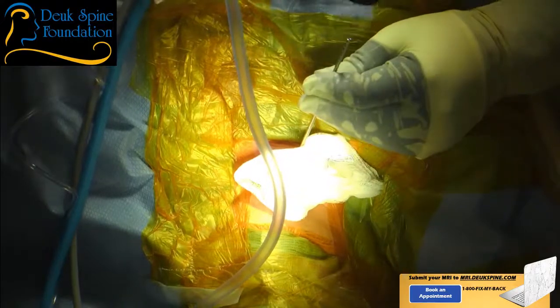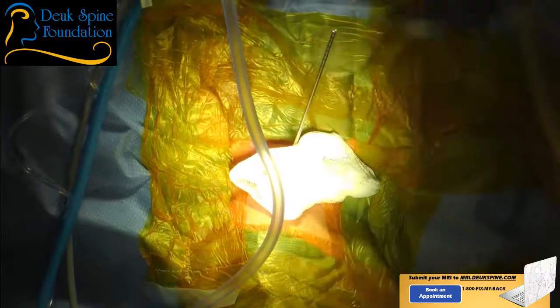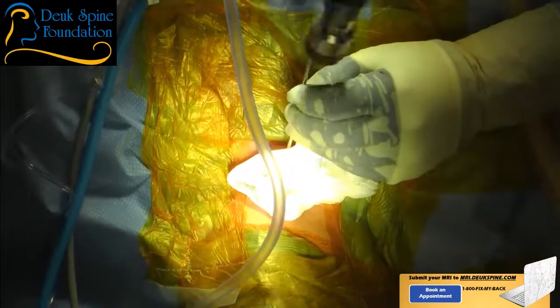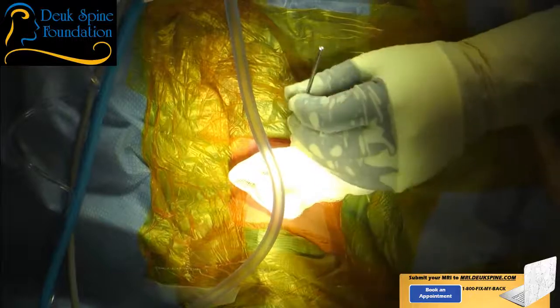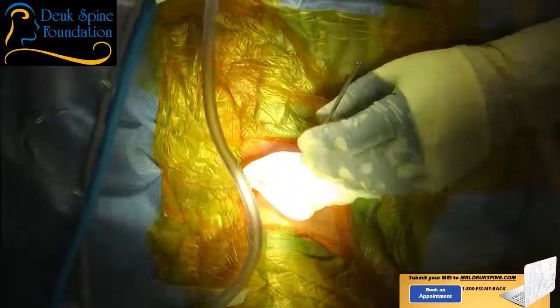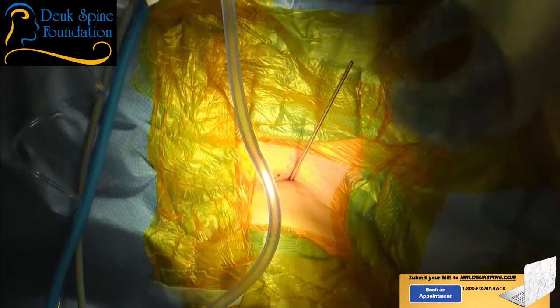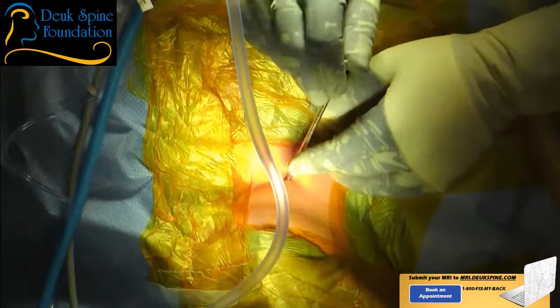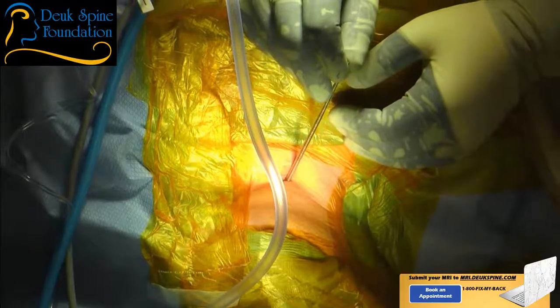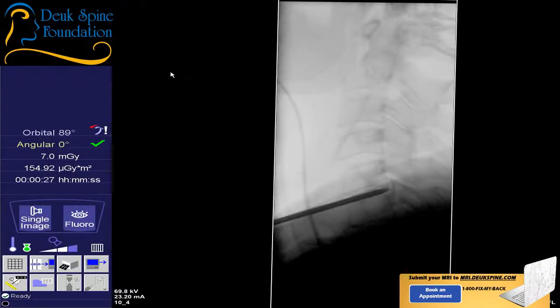All right, there's still some discogram dye left back there. You can see it outlining the herniation at this level. I want to bring my dilator all the way back to the herniation. And basically, it's at the back of the disc, and it's right where the bones end. You can kind of see the outline of the back of the vertebral bodies and the back of the disc, and you can see the herniation goes past that. See the tip of the dilator there? Just to the right of it, it's like a little arc in dark, a dark arc. It looks like just a bent line running from the middle of the vertebral body above down to the third way down in the next vertebral body. And that is the outline of your herniation.